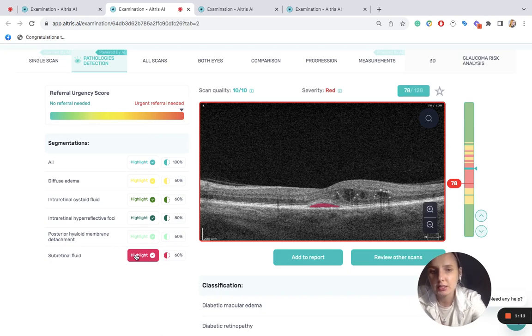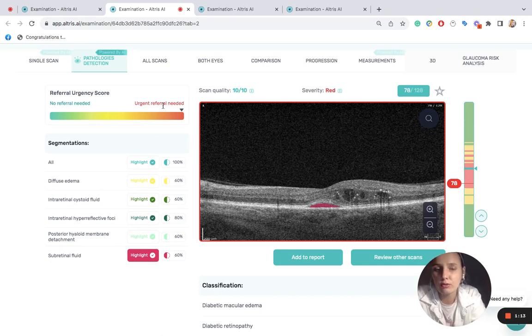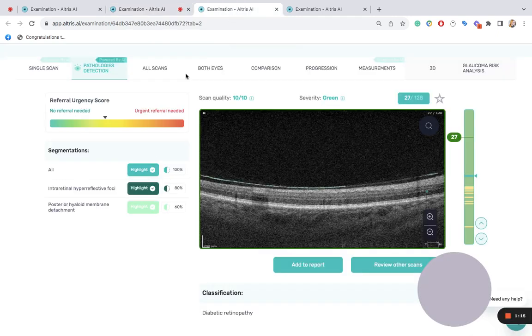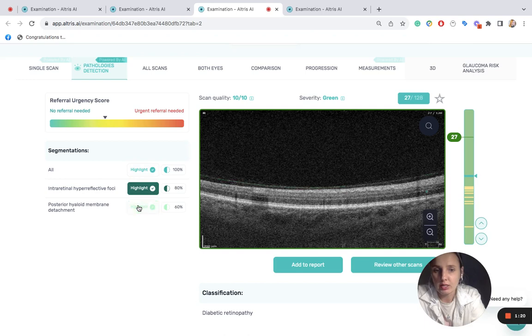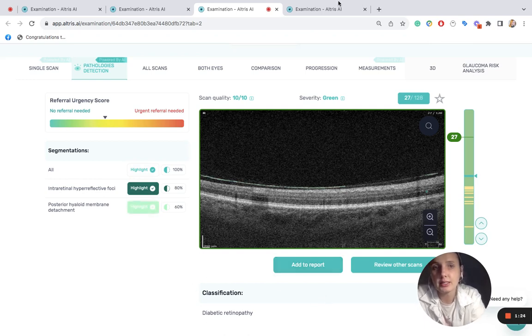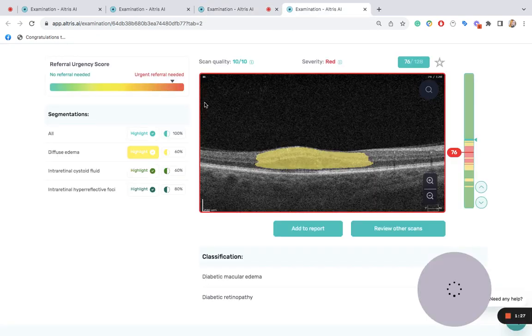Let's take a look at the right eye of the same patient. On the 27th scan, the diabetic retinopathy is detected with minimal changes. And let's take a look at the dynamics in three months.